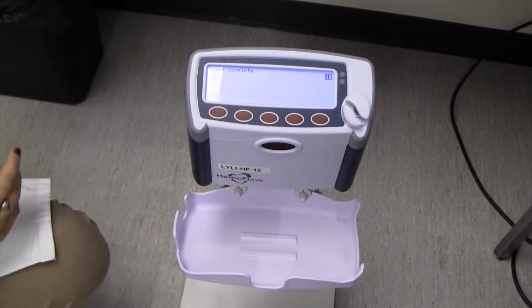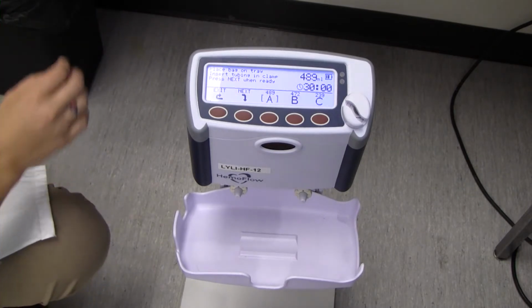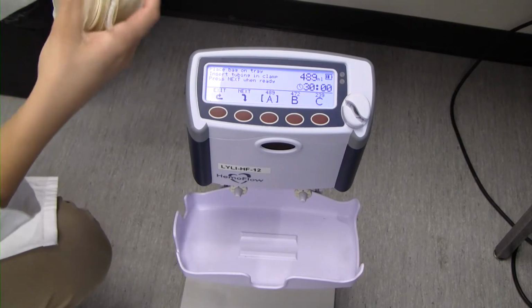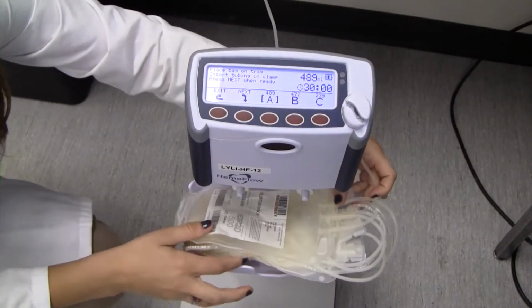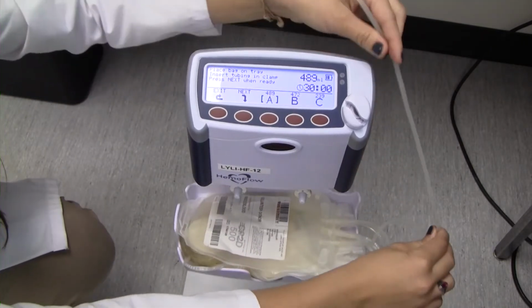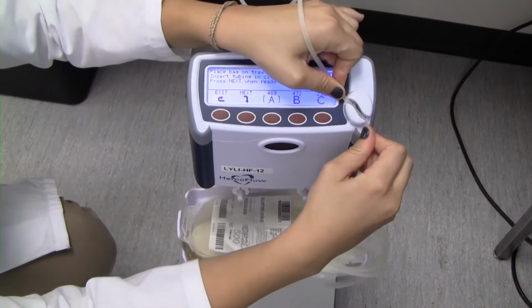Follow screen prompts to place the bags on the scale. Place the RC2D or RCPL bag on top of the satellite bags. Ensure inline filters are towards one end of the tray and under the collection bag. Thread the donor line tubing through the clamp, leaving an approximate 2-inch loop of tubing hanging below the bag tray. Rotate the tubing clockwise through the clamp, securing it under both clamp guides.